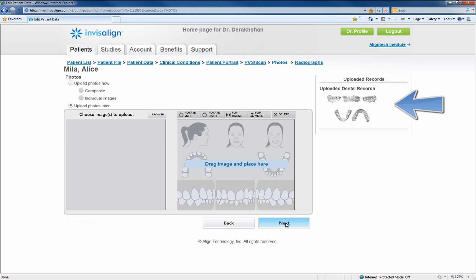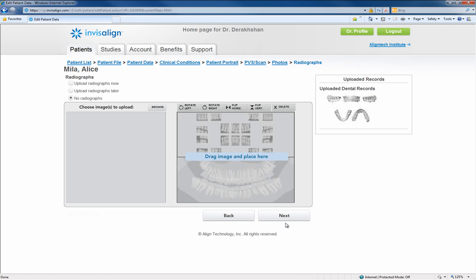This page is to upload patient pictures, which you can do now or choose to do later. The next record, radiographs, is also optional. Click Next to finish.